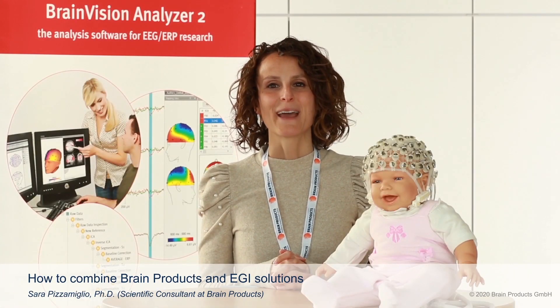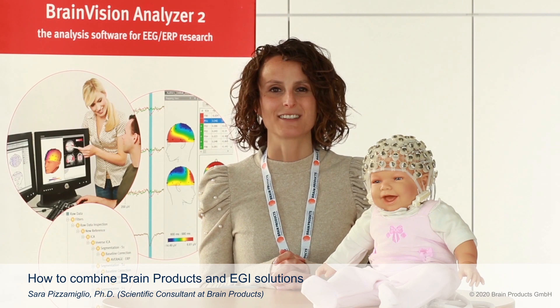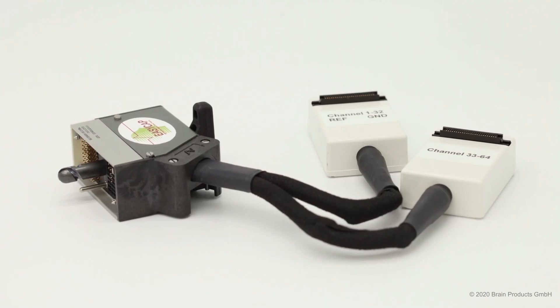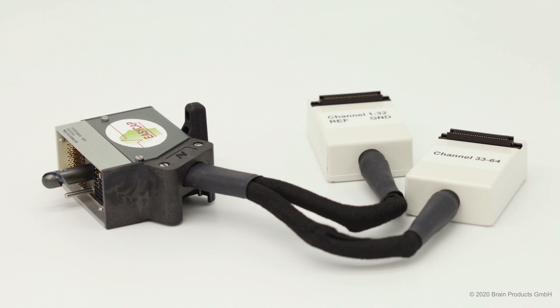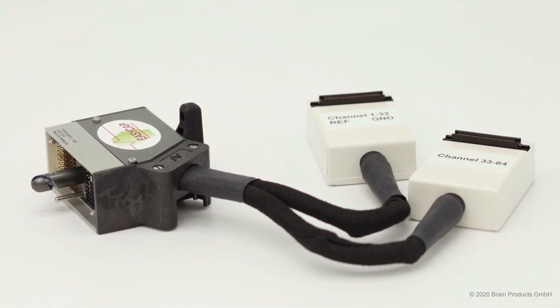Hi, my name is Sarah and today I would like to show you how you can combine BRAIN products and EGI solutions together. I'm happy to let you know that from now we can provide you with adapters to connect 64 or 128 channels R-Net and ActiCap Slim to any Net Amp amplifier, and they are very easy to use.